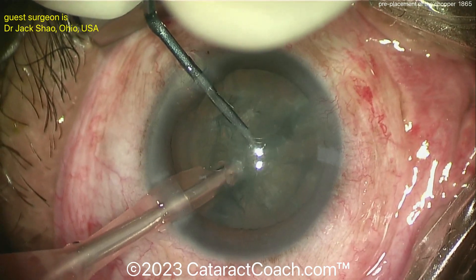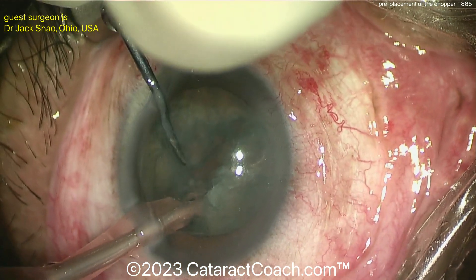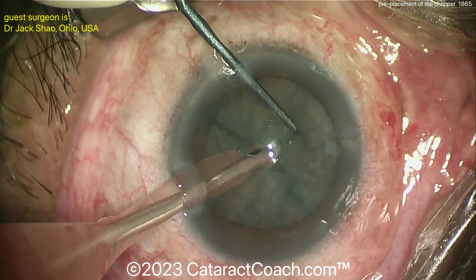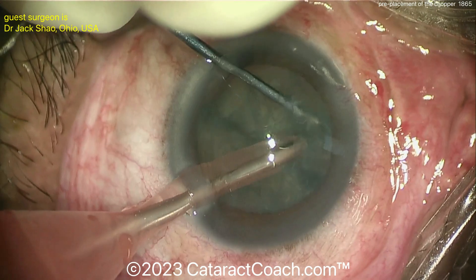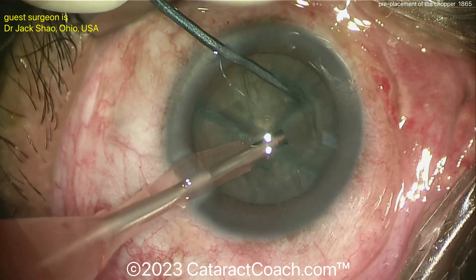The technique we normally do is we buzz in the FACO probe first to hold the nucleus, then place the chopper. But remember, it's time-sensitive, because you only have so much holding power in terms of time — once you have that FACO probe embedded in the nucleus, it'll start to eat away at the nucleus. You only have a window of maybe a second or two.